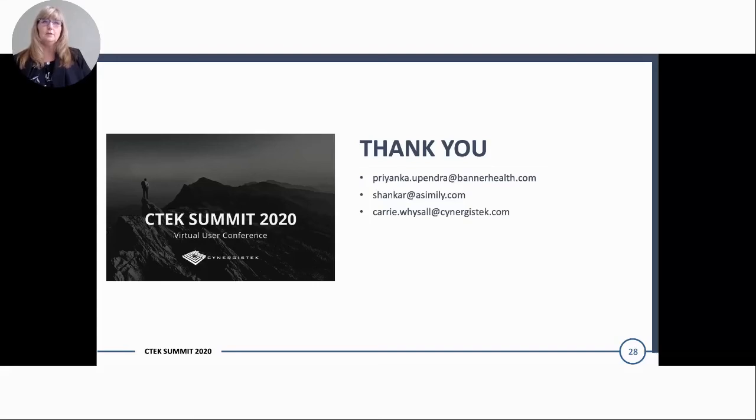There's lots of things that you can do with Windows XP. Obviously, segmentation is step one. If they're already segmented, but unfortunately you have all of them in one segment, take a look and fix that. But one thing that we really had success with in the past is whitelisting. There are a lot of opportunities to use tools like Solid Core, although I think the name has changed now. But really what we did was put it on the devices, ran it for 2 weeks in monitor mode, looked at what that device needed for executables, and then basically blacklisted everything else. So there are options there.